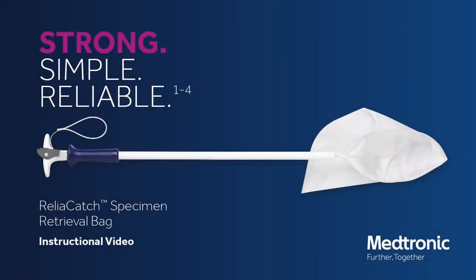Introducing the Reliacatch Specimen Retrieval Bag, a strong, easy-to-use specimen retrieval bag that you can count on during laparoscopic procedures. This video will demonstrate how to use the Reliacatch Specimen Retrieval Bag.